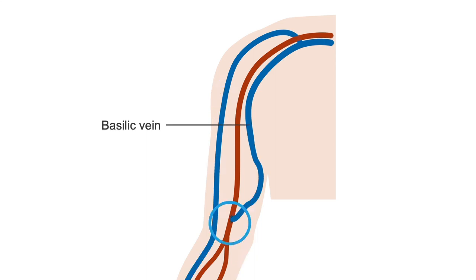For brachiobasilic fistulas, the locations of the basilic outflow vein measurements are at the same points in the upper arm.